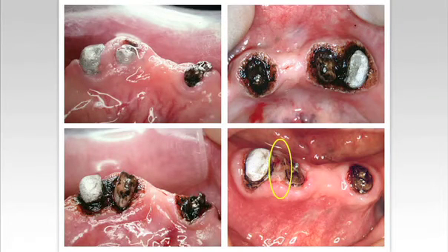An elderly patient with a mandibular overdenture and many problems in the few lower teeth that were supporting this. The patient has a severe coagulation disorder, and, for added complexity, there is an aberrant arteriole running between the two central incisors in the area shown in the oval highlight. The pre-op situation is shown on the upper left. This arteriole was uncovered during the gingivectomy, which made the appointment even more exciting.